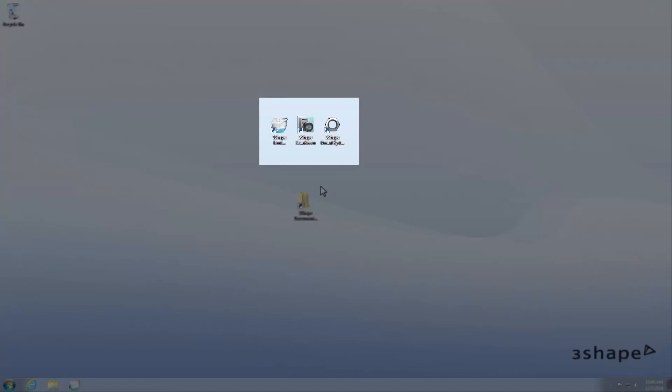A scanner should be delivered to you with a compatible PC on which software is already pre-installed. You will find your login and password with the supplied documentation. If you need any help, ask your reseller or contact 3Shape support. All installed 3Shape software icons will be visible on the desktop, and the exact location of the user guide on your PC will also be noted in your supplied documentation.